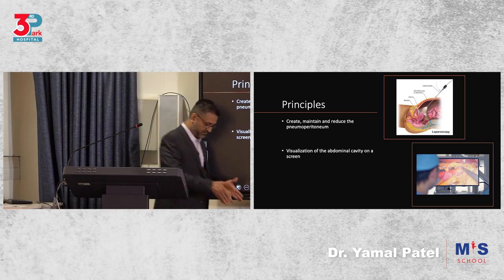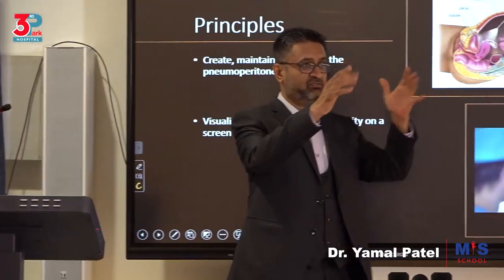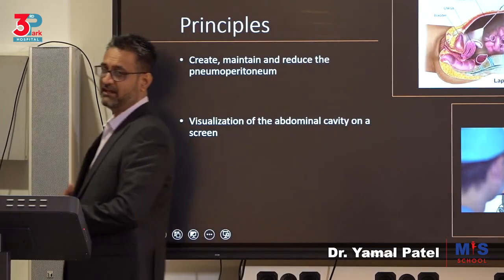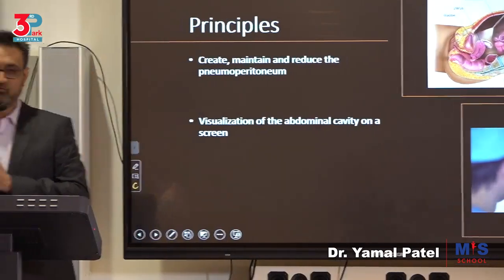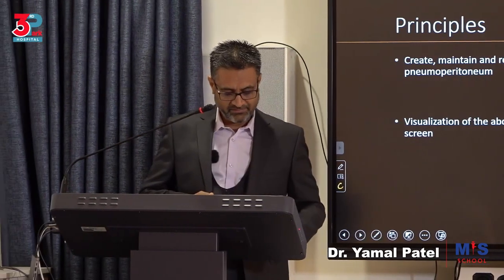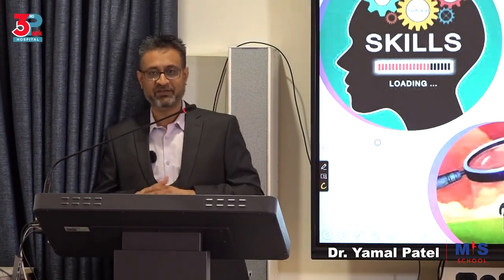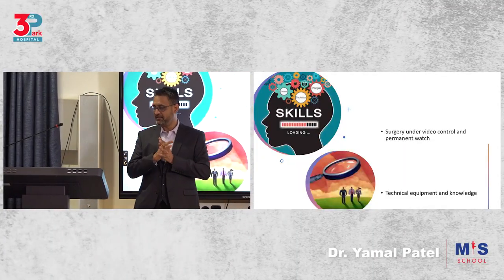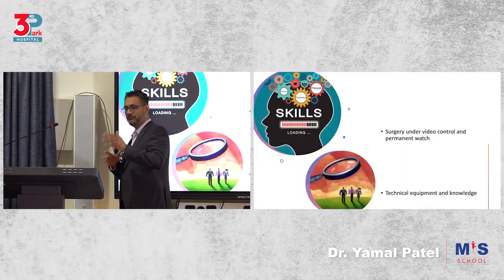The next one is you're going to visualize this on a screen. So it's not direct vision, it's visualized on the screen and operate. So your motor access and your visual access will have to be trained to do surgery in that way. So that is something we have to keep in mind. We have to keep in mind that surgery in MIS is always under video control and permanent watch.